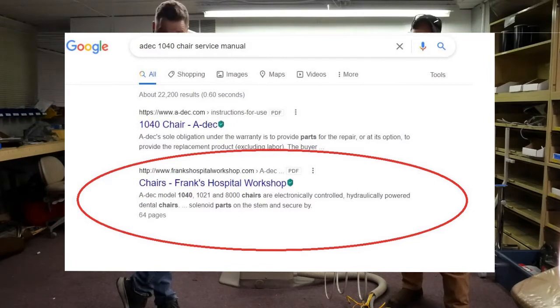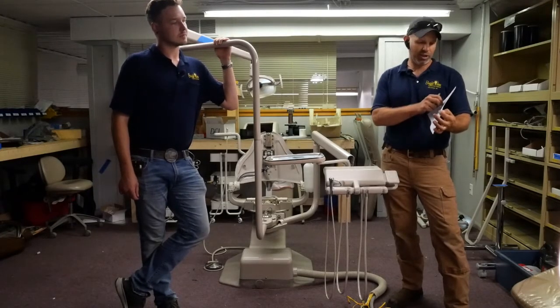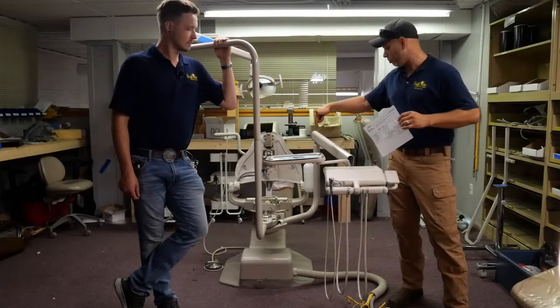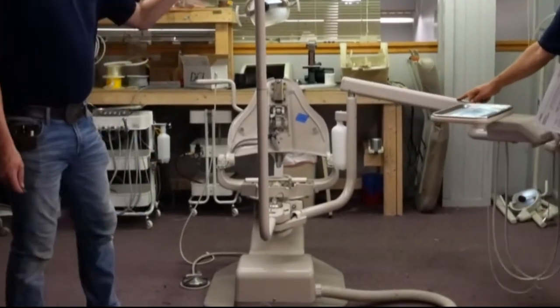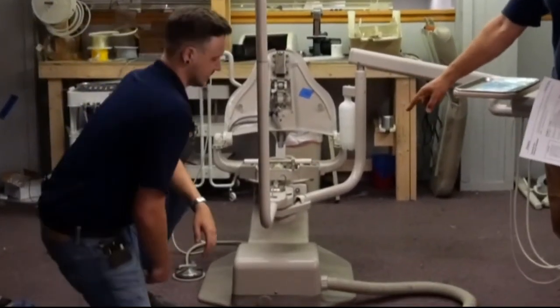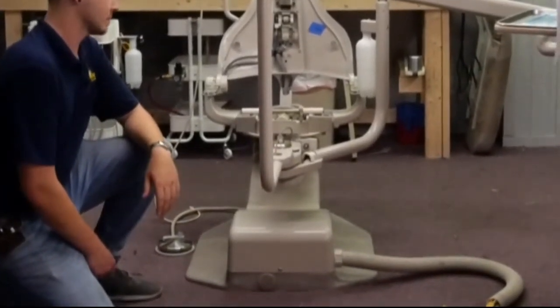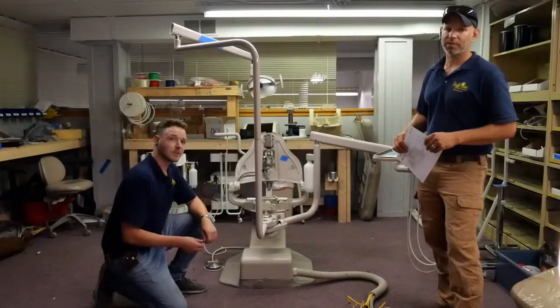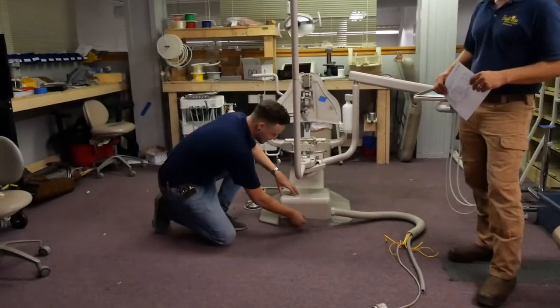Now inside the service manual there's actually a procedure, and this particular procedure is called hydraulic manifold, adjusting the hydraulic manifold. So in order to do what we're going to do today, Calvin is going to open up the pump housing on the bottom of the chair. Now on these chairs, it's usually right here at the base of the chair, and we have the cushion off for easy access, but yours will have a cushion on it, so it'll be a little bit tougher to get to it. First, you got to get your handy dandy 5/32 Allen wrench. We got 3 bolts down here we got to take off.